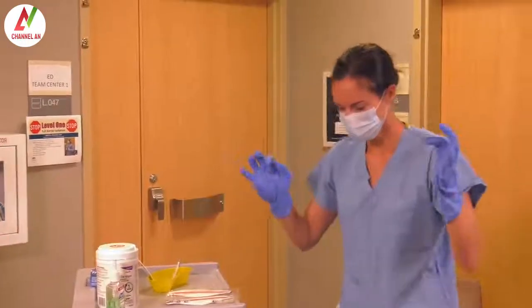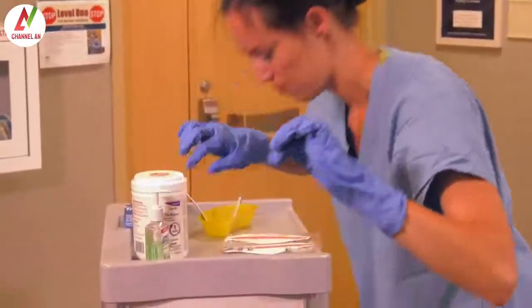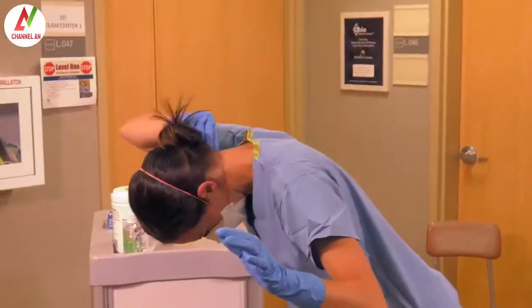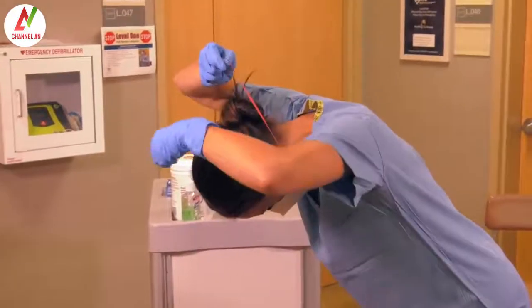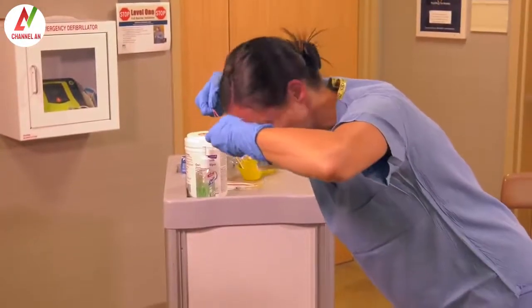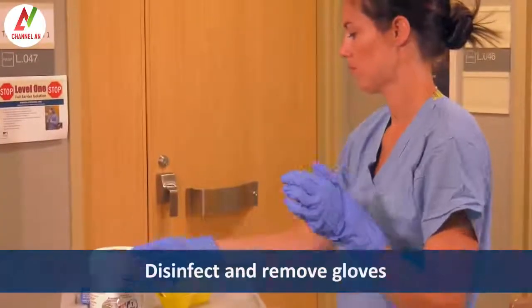Now, she removes the face mask, taking care not to touch the front of the mask or respirator. If Heather used an N95 respirator, she would remove it now by tilting the head forward, grasping the bottom elastic strap first, then the top elastic strap, and pulling them over her head. If she used a PAPR with a self-contained blower in the helmet, she would remove it now.